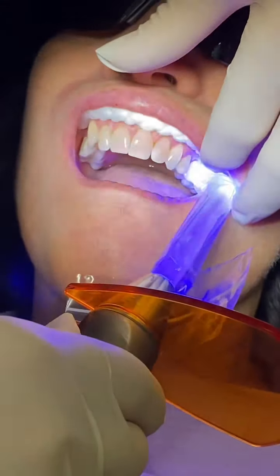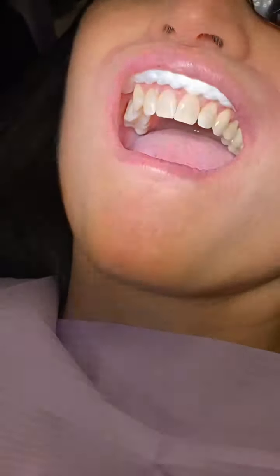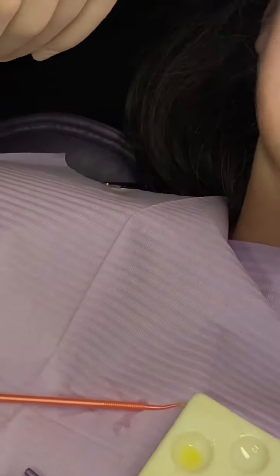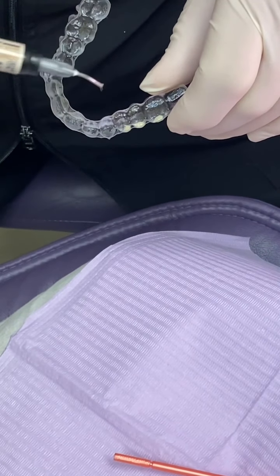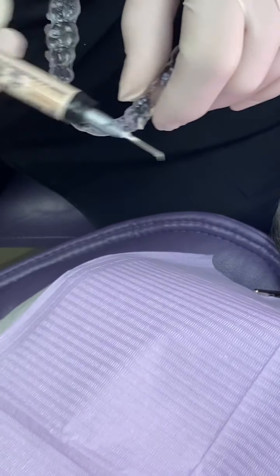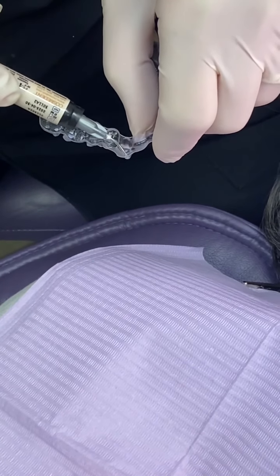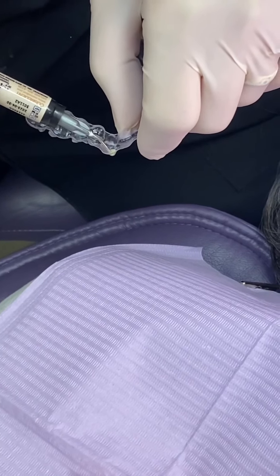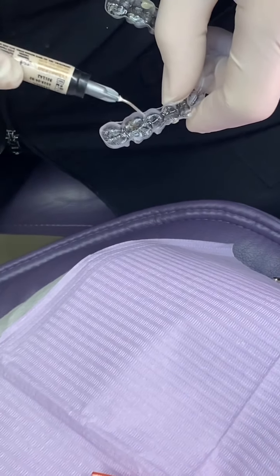We're now setting the bonding agent — that's the step before using the template. Then we take the heated enamel flowable micro-fill material and place it in each attachment position in the template, and then the template is placed in the mouth. We've already tried the template in and know it fits exactly, so it's just a matter of putting the flowable material into the template and placing it in the mouth to set each attachment.